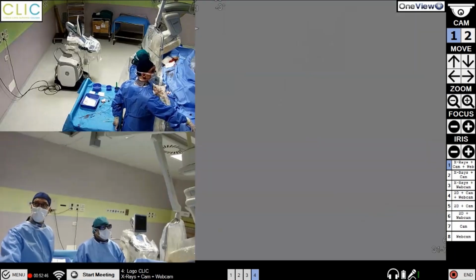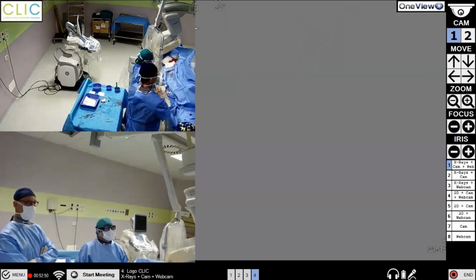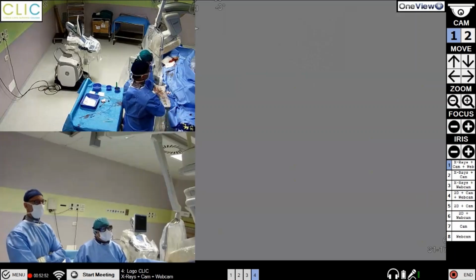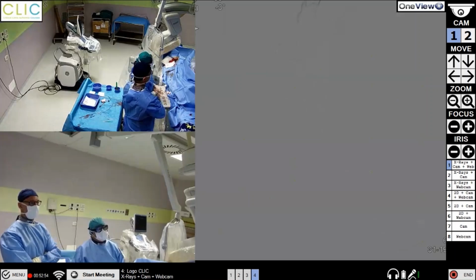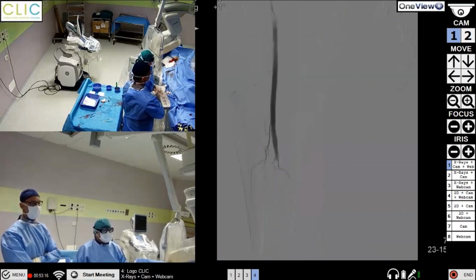With the contrast medium, you can see the foot. The angiographic aspect is a little bit different. You can see here the peroneal artery arriving at the ankle level with some collaterals, and the foot seems more like a desertic foot compared to the CO2.